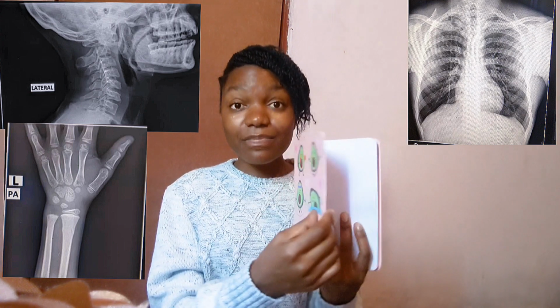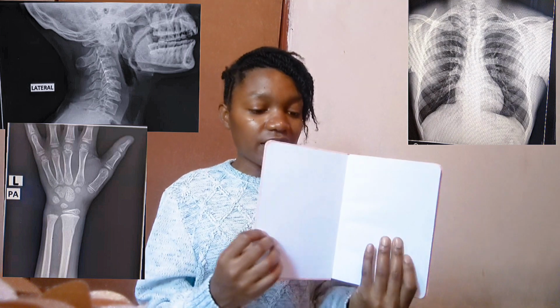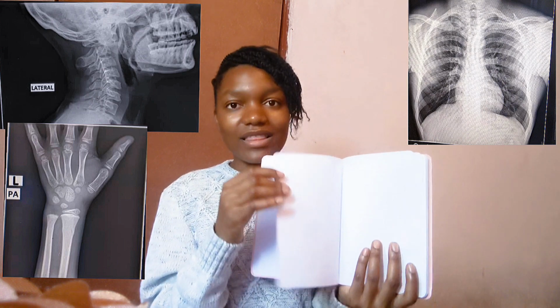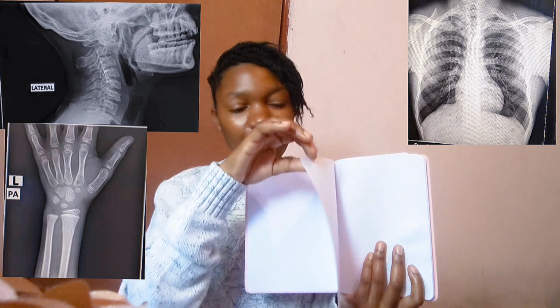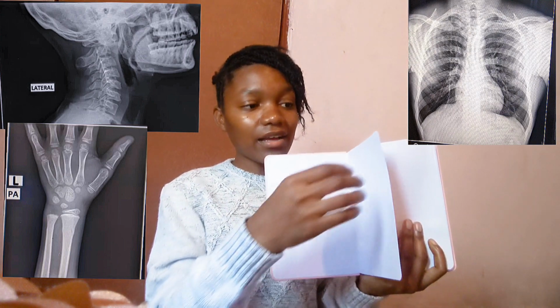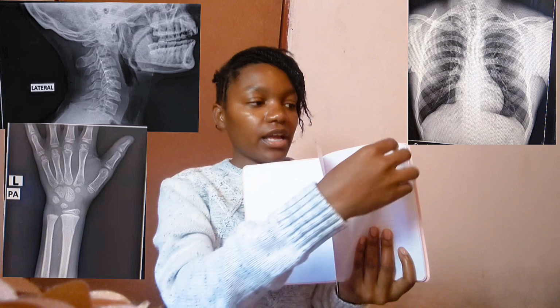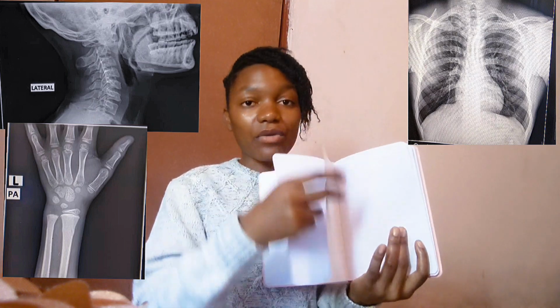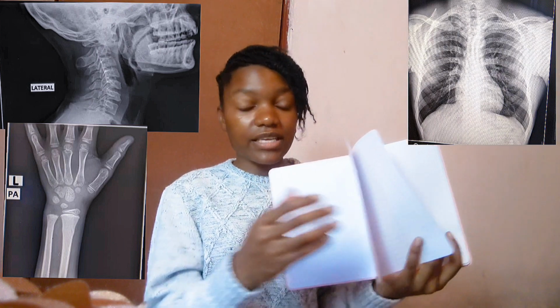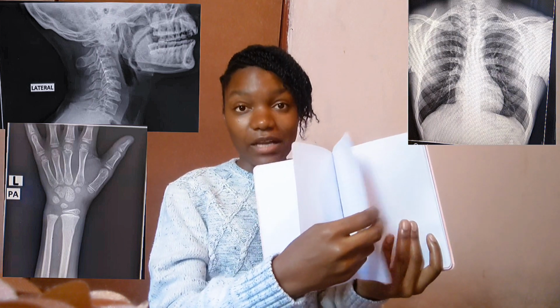So this is the hard part, and we are going to take this part as the denser part, right? It's very dense. Then it also has this other one, which is a bit thick, thick compared to this one. So this one is denser compared to this one, and this one is less dense compared to that one, right? Then there is this part, which is very thin. So we have three areas here: the denser part, the dense part, and the less dense part, right?